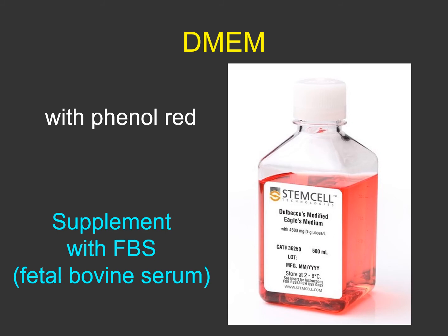And these growth factors are usually very helpful for cells. And so if you don't want to specifically add all these growth factors, or you don't even know what growth factors specifically help your cells, the addition of fetal bovine serum, FBS, usually around 10%, will have all of these things in it. They'll help your cells to grow. And then sometimes you can add other supplements to the media.